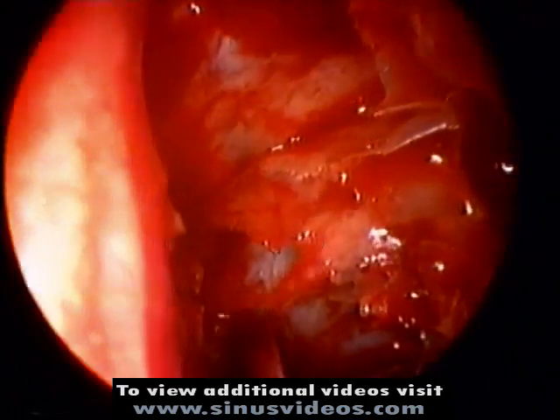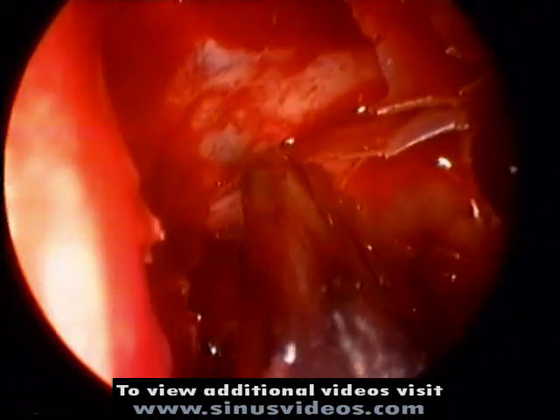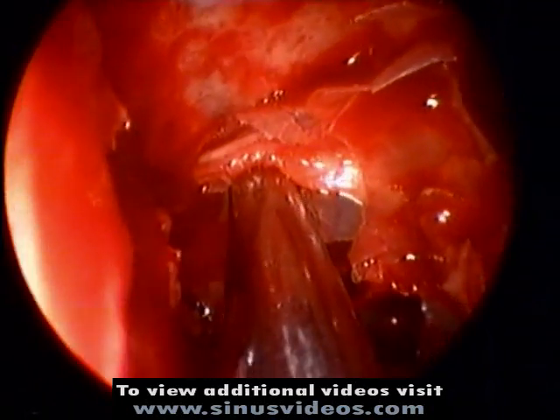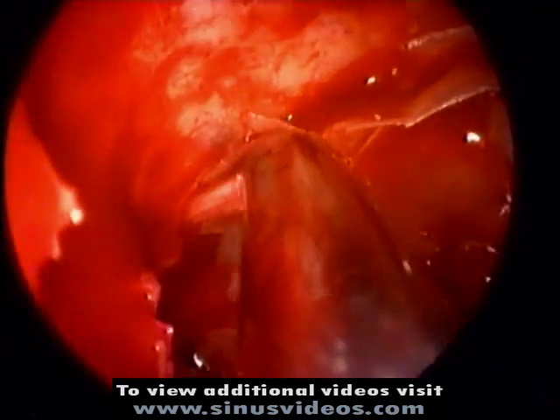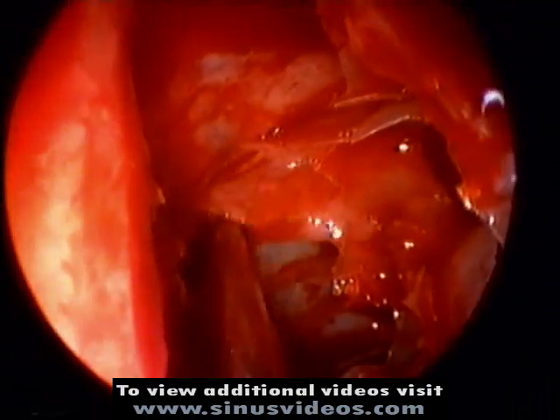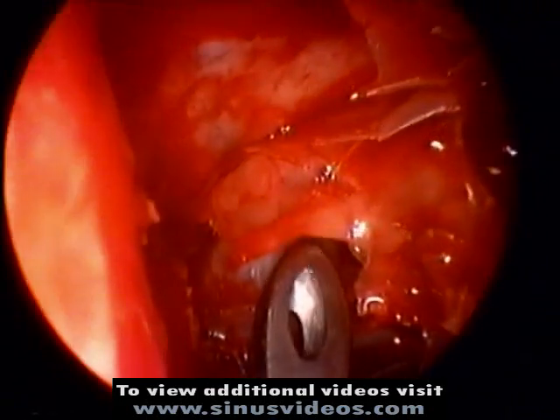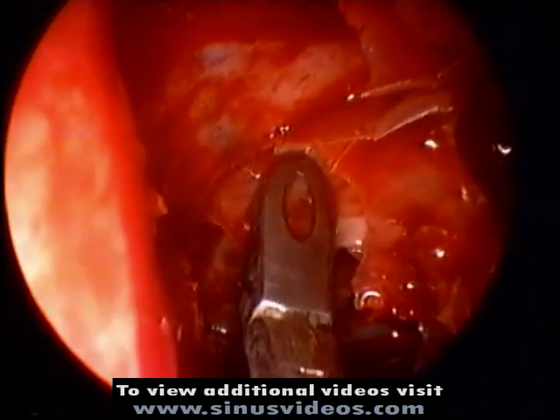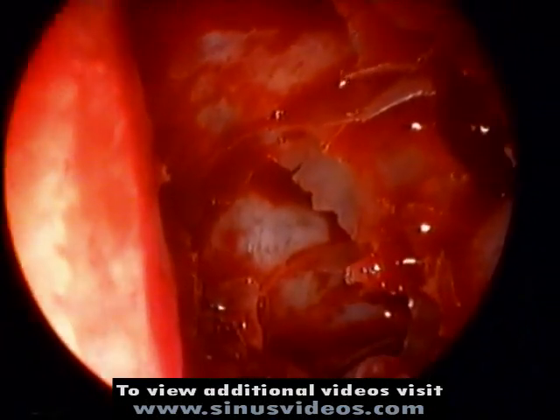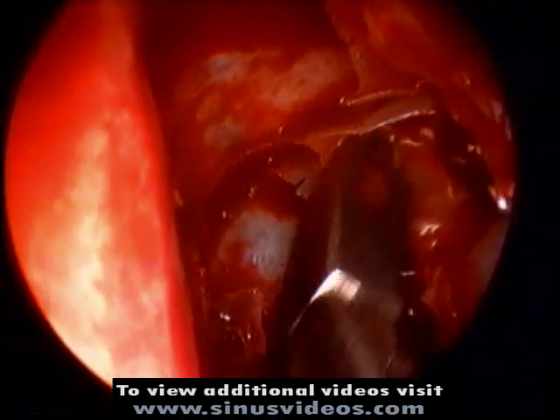We see here more posteriorly the remnant of the vertical portion of the basal lamella where it attaches to the ethmoid roof. Some mucosa as well as some residual bone is evident in this region, and this can be removed with the Blakesley forceps. And a remaining posterior ethmoid air cell is opened and removed.